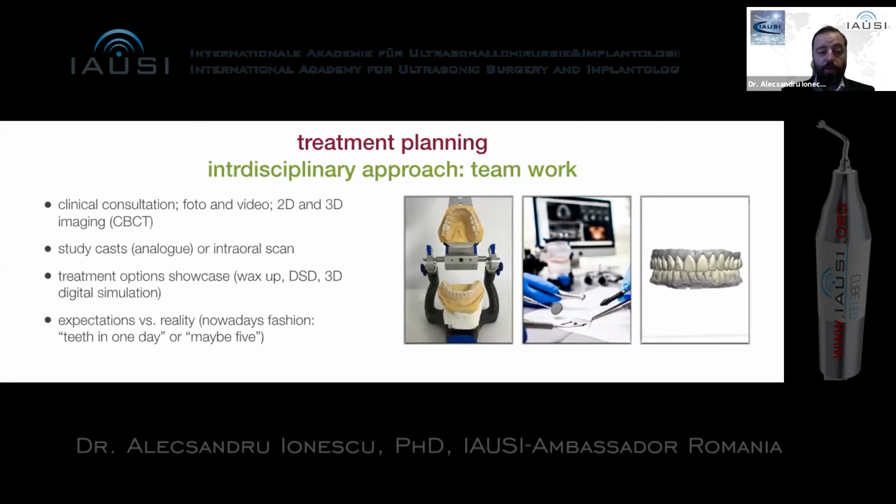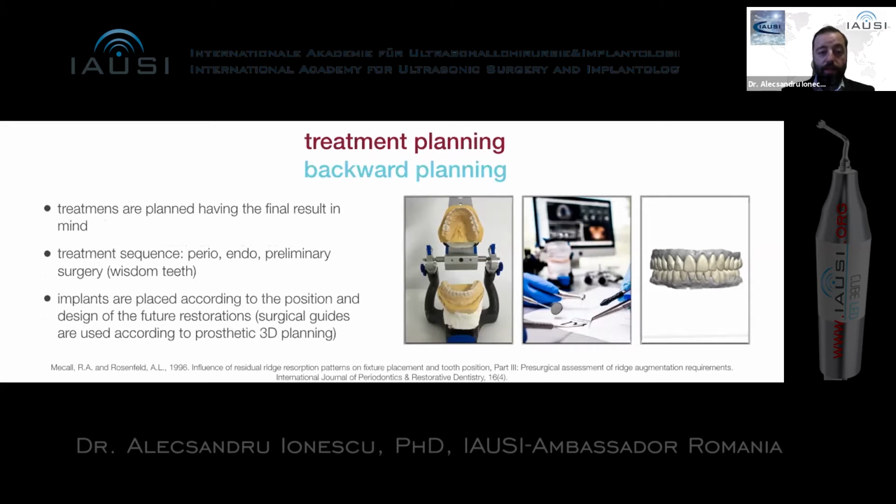We used to do study cast, but we do now just intraoral scan, because we can do a faster digital workflow to let the patient know how it's going to be in the end, and also to be able to prepare the treatment steps. We need to be very fair with the patients in terms of expectations versus reality when we are talking about the teeth in one day or maybe a few more days.